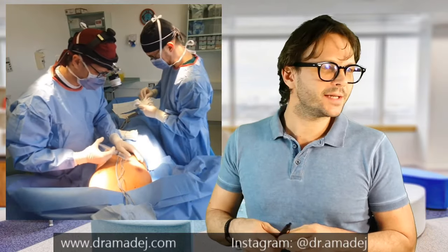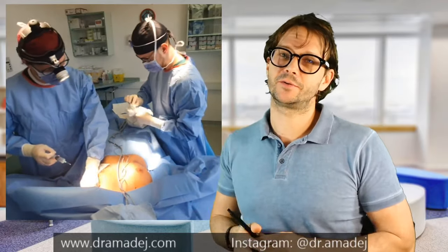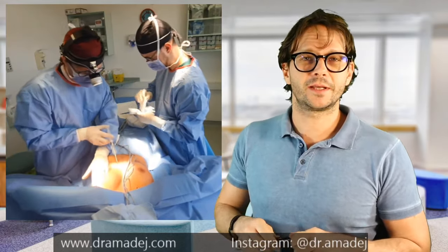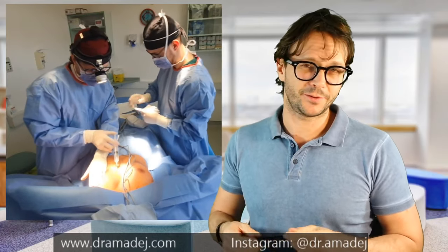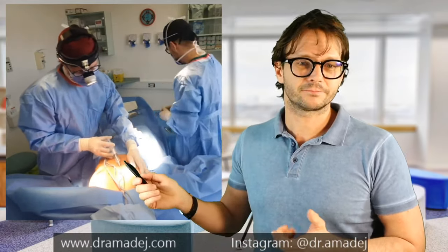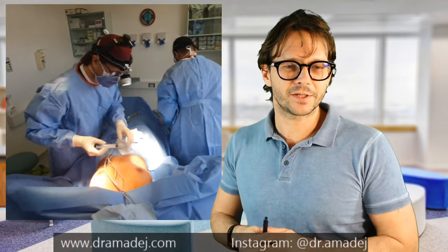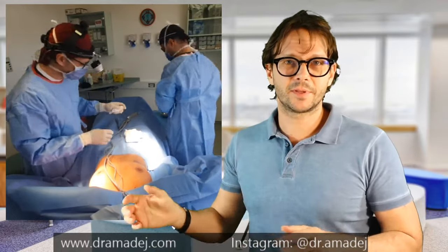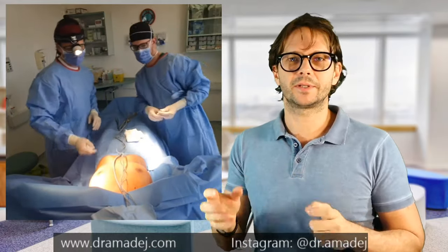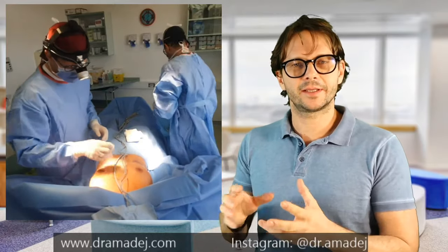We are doing live surgery today. I hope you're not offended by some of these pictures — I limited the video to 18+ so hopefully no kids are watching. This is completely educational, so it should be fine by YouTube standards. As you can see, we are in our operating room starting the breast augmentation with one of our patients. It's a quite simple procedure and the right length so I can explain how it is being done.